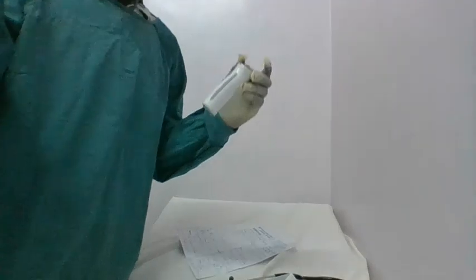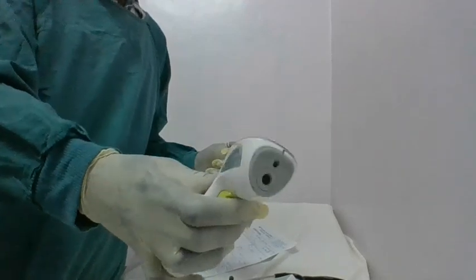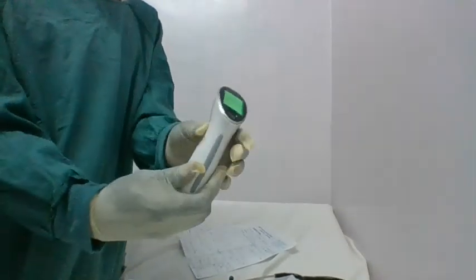So guys, another thing we're going to take is the temperature reading of the patient. We can have the mercury thermometer, which currently is in the other unit, and I don't want to go and take it, guys. We're having this infrared thermometer. It's a very easy one to use. So guys, you just go to the patient's forehead, you point the thermogun at the patient. Basically, it's going to display the temperature reading of the person that you're taking the temperature of. And guys, now I'm talking of the stethoscope.